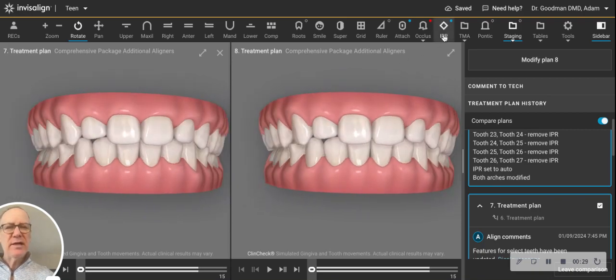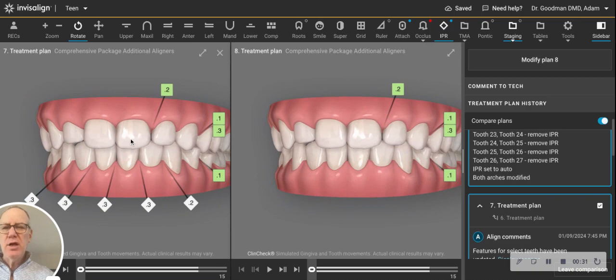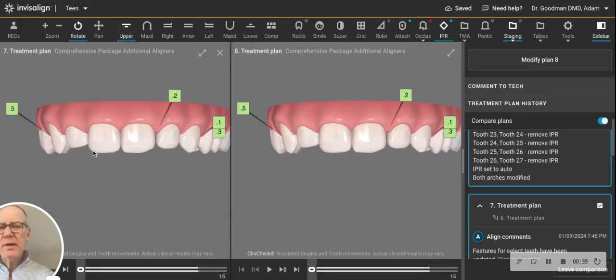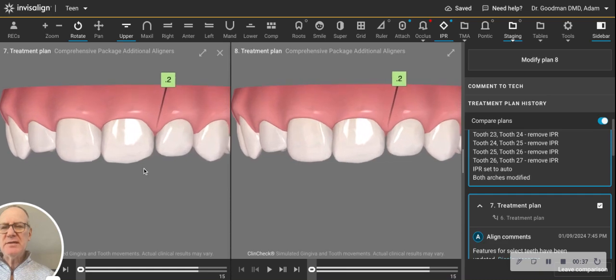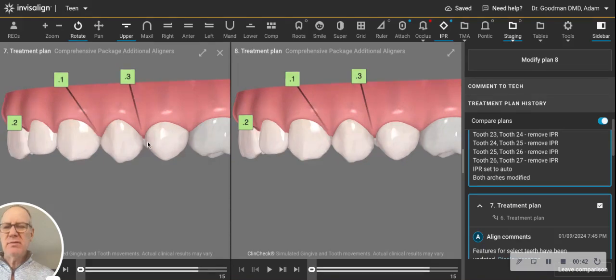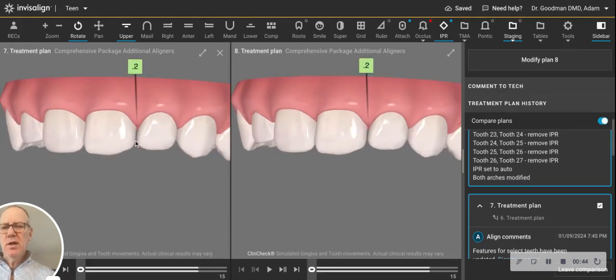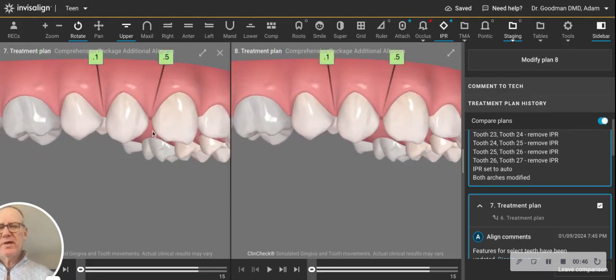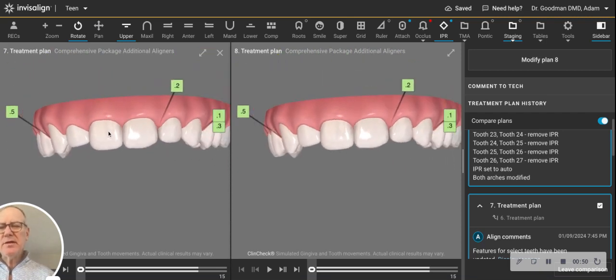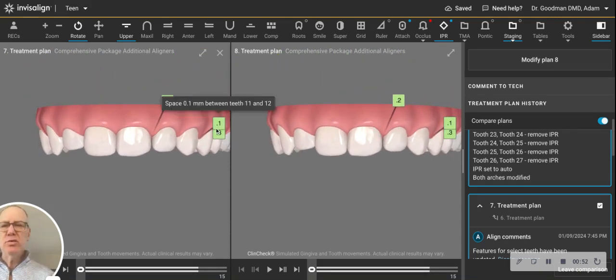When I click this little thing here, do you notice the green on the upper? The green on the upper corresponds to spaces that remain between your child's teeth. There's one there, there's some there, and we have over here. Now, these are small spaces, and theoretically they are not hard to close.